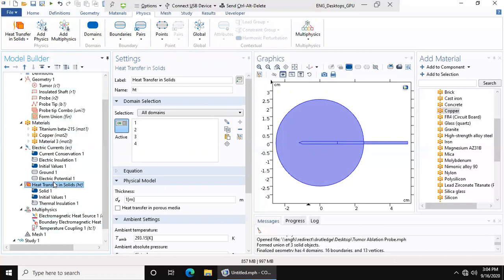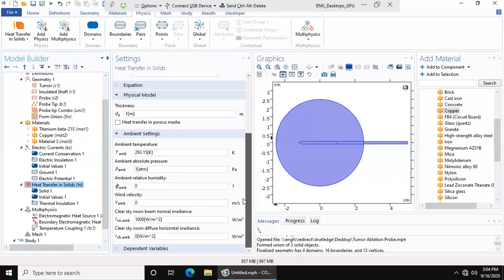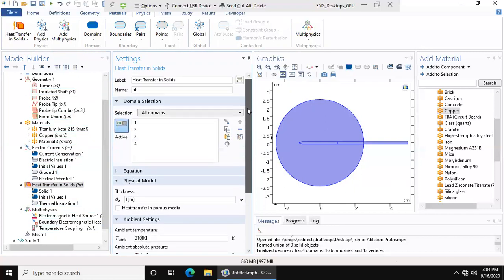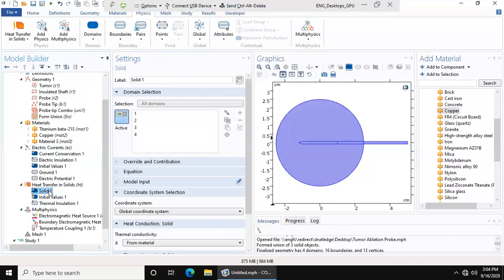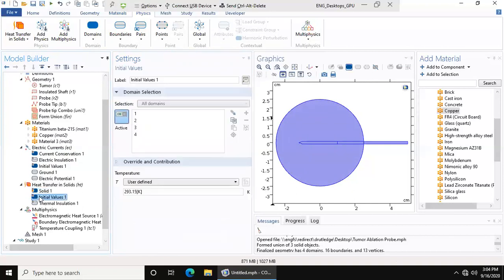Now we go to the heat transfer in solids. Again, you want to make sure everything's good, but ambient temperature is not going to be room temperature, it's going to be body temperature, which is 310 K. All this is from material, initial values 310 K.